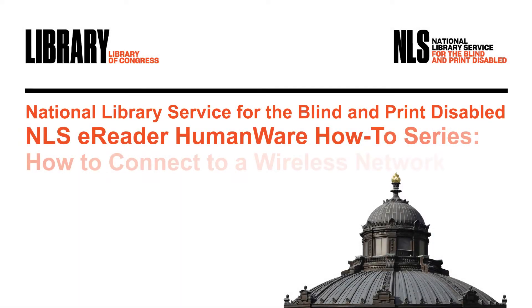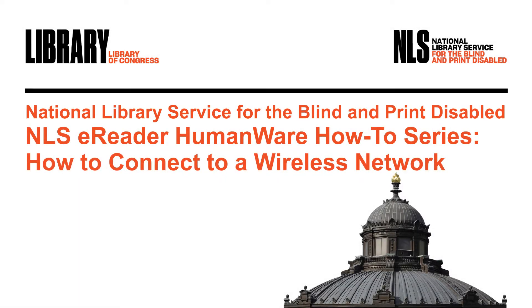NLS eReader HumanWare How-To Series: How to connect to a wireless network. Hi, I'm Judy Dixon, Consumer Relations Officer at NLS. In this edition of the NLS eReader How-To Series, I'm going to cover how to connect the device to a wireless network.